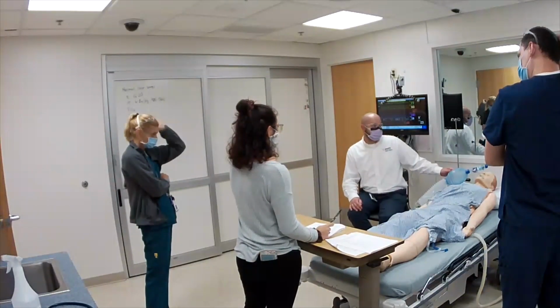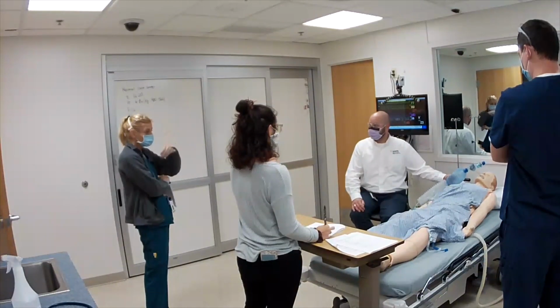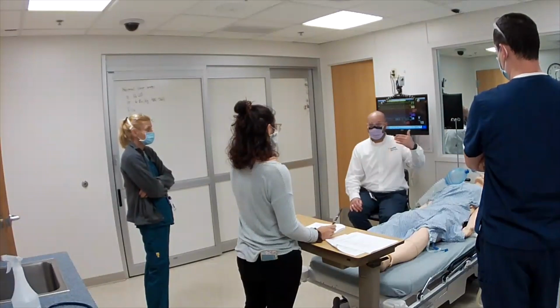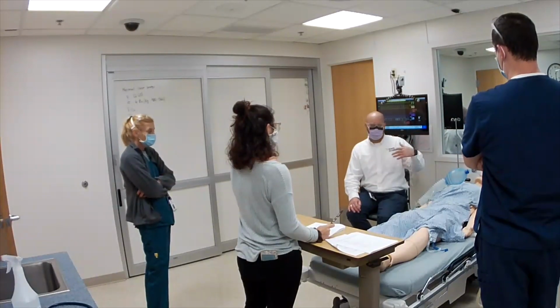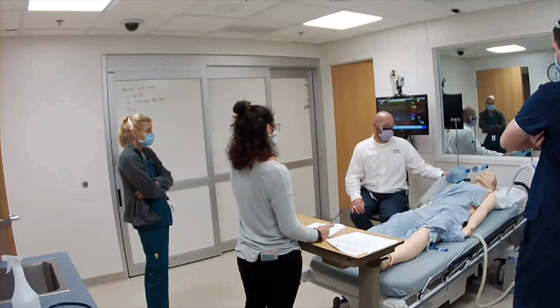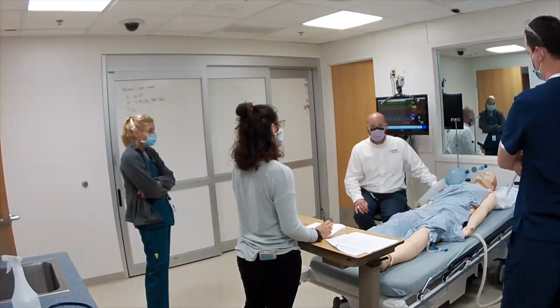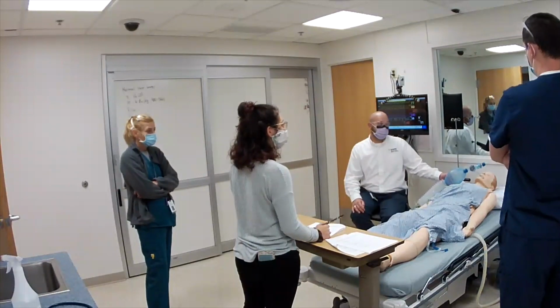So just for the ease of today, let's just turn it down, and we'll make that a negative number. But that's really the same as your PEEP, right? So you can't have it over PEEP or the vent will never stop, right? But you don't want it too far down because he's going to have to pull really hard to draw that breath, right? So that's where we set our trigger.